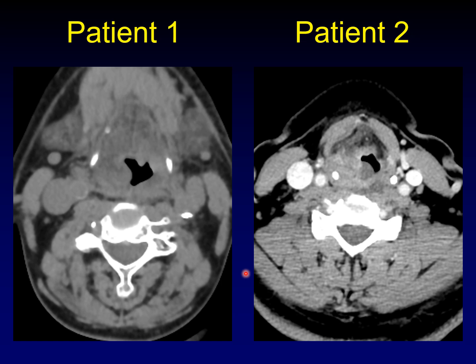In patient number two, what we're seeing is the effect of an acute infection, probably superinfection of that saccular cyst shown on the last slide. You can get asymmetric enhancement and it can arise within the larynx, or it can be secondary in the larynx to an infection elsewhere in the head and neck, such as in the oropharynx spreading down into the neck.